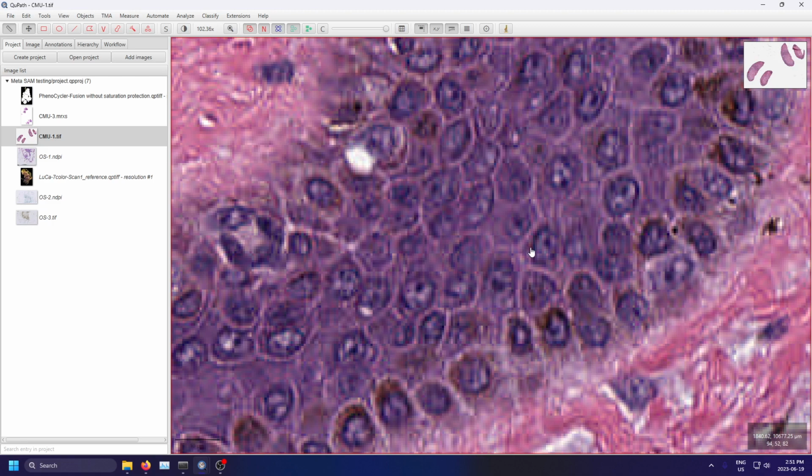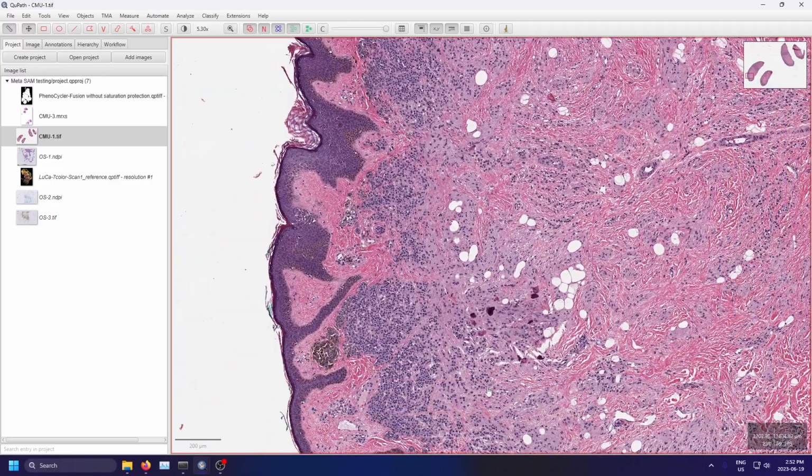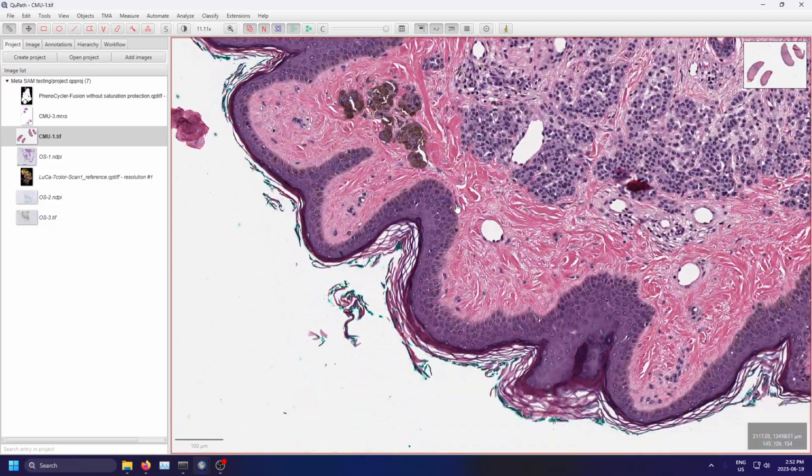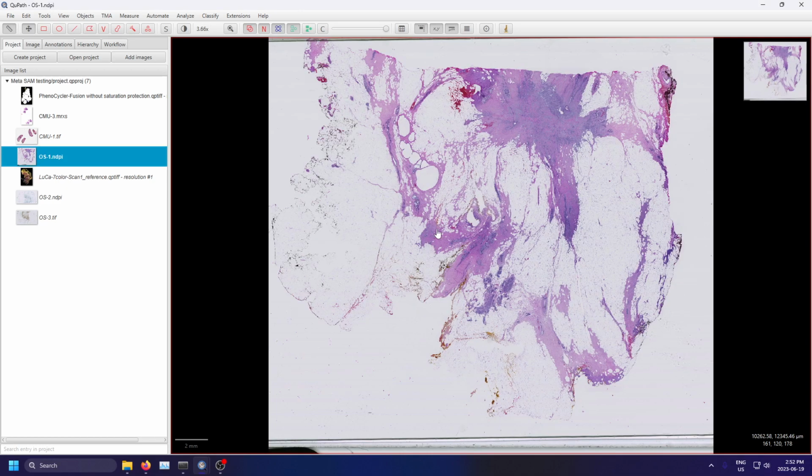I don't think it has the capability to really separate cells that are very ambiguous in terms of their nuclear border. If anything, it seems like it's clipping towards the edge of some kind of JPEG 2000 compression artifact. But this extension is still early on in its development, so I'm sure there might be ways to account for this. All right, so let's move on to another example.